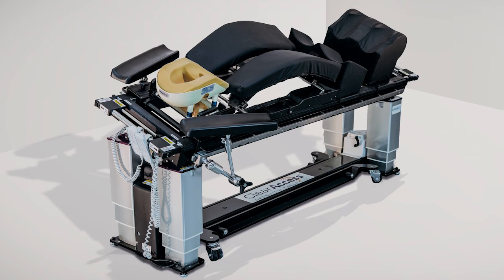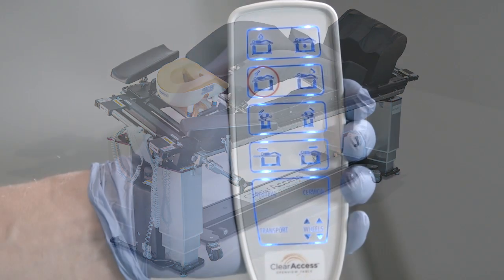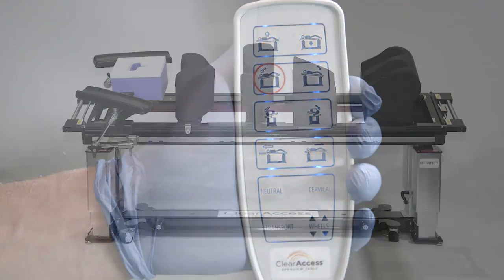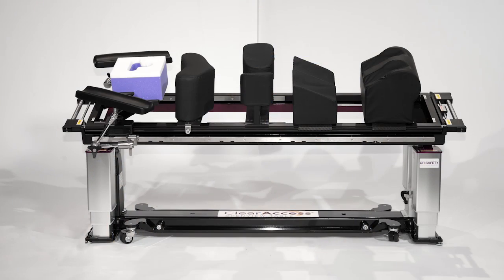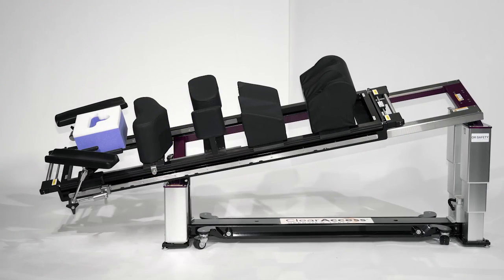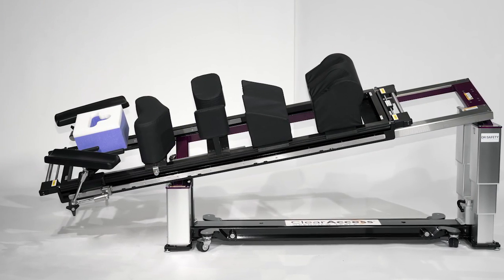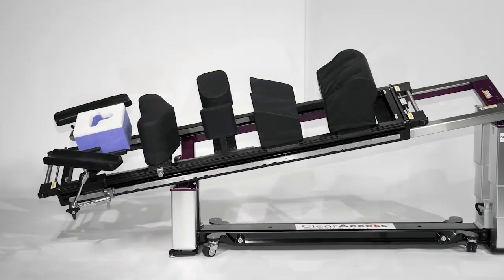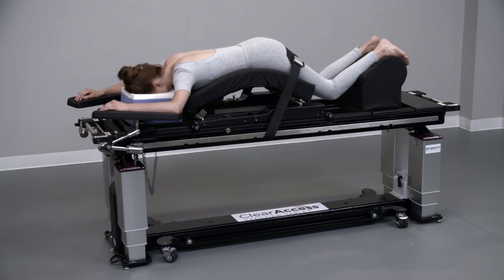For these types of procedures, the surgeon has the ability to use a sterile-draped dedicated hand control to manipulate the table using fully motorized lateral roll, Trendelenburg and cantilever to optimize the surgical approach angle and to facilitate easy C-arm and O-arm imaging. Setup of the prone positioning components shown here can be completed in a few minutes. Let's review the correct setup of these components, including alternative leg management solutions.